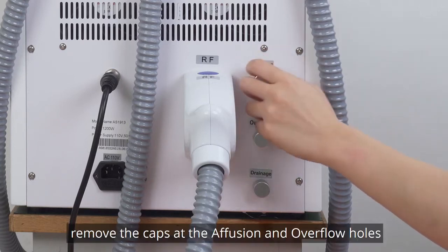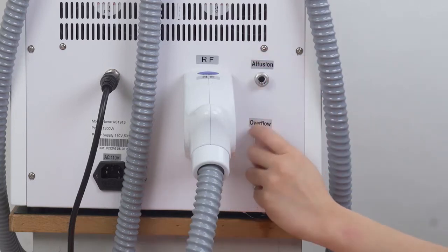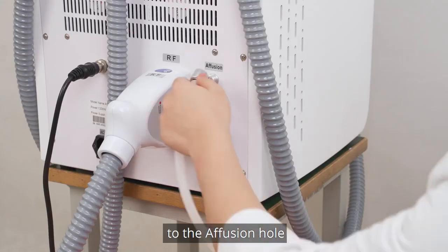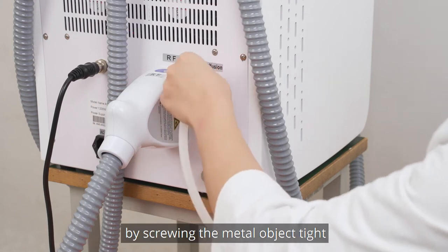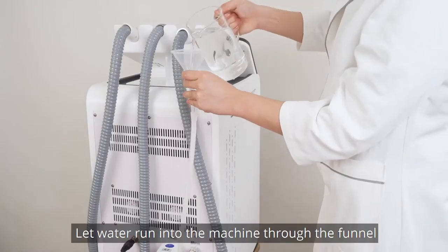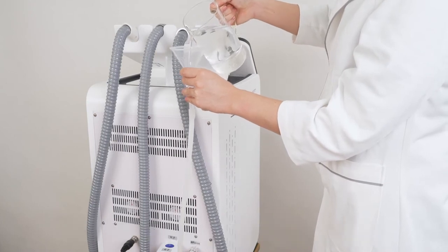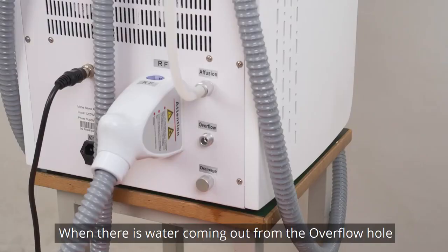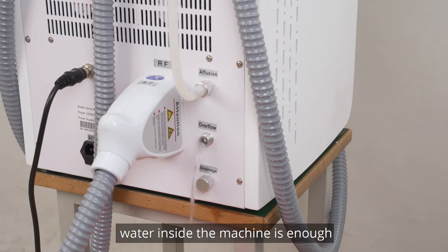Remove the caps at the infusion and overflow holes. Connect the hole at the end of the funnel to the infusion hole by screwing the metal fitting tight. Let water run into the machine through the funnel. When there is water coming out from the overflow hole, the water inside the machine is enough.